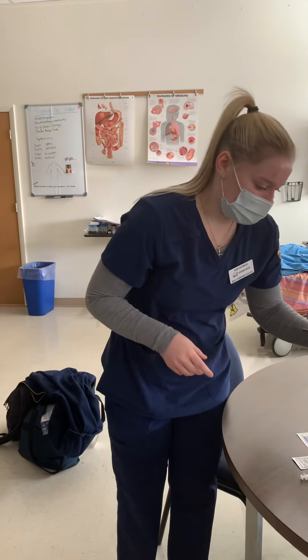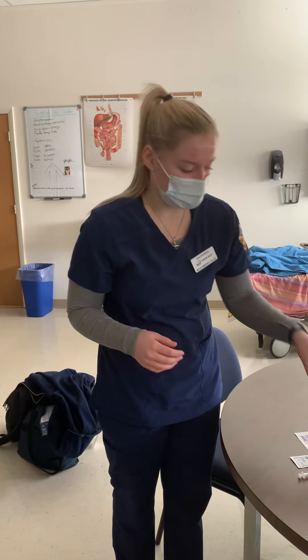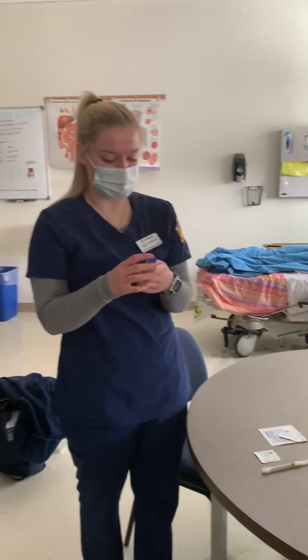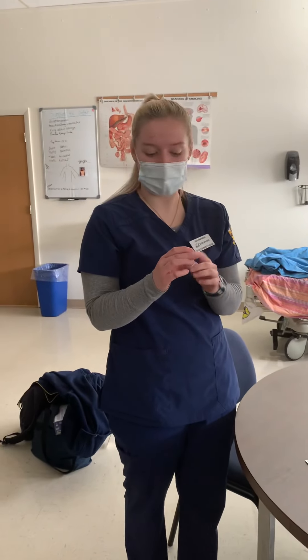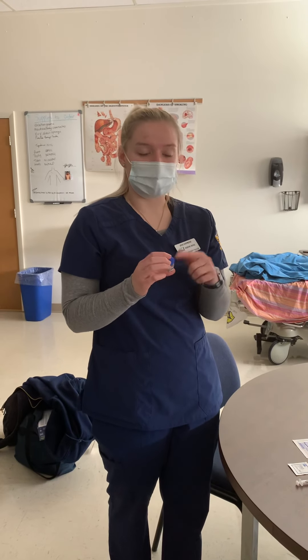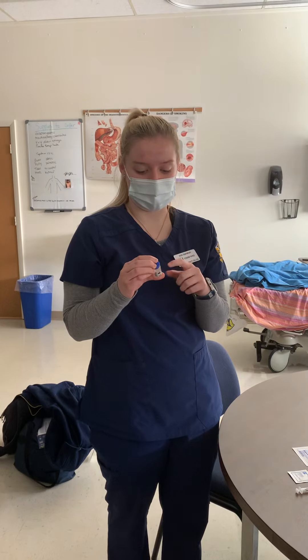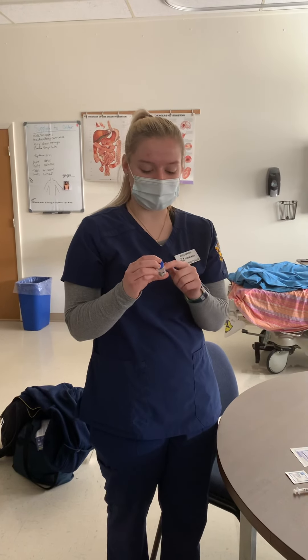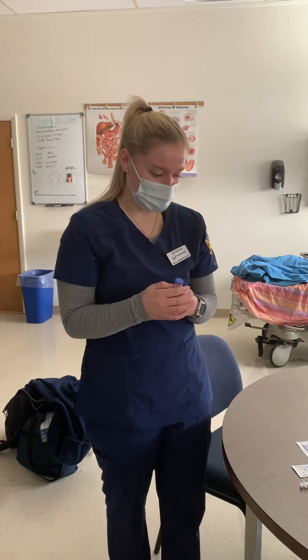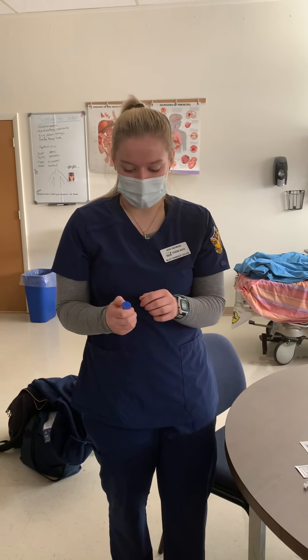I will check my order, get the correct medication, and check the vial for any cracks or anything like that. If it's a multi-dose vial, I will check for the previous nurse's initials and the time they opened it. Then I will uncap my vial.